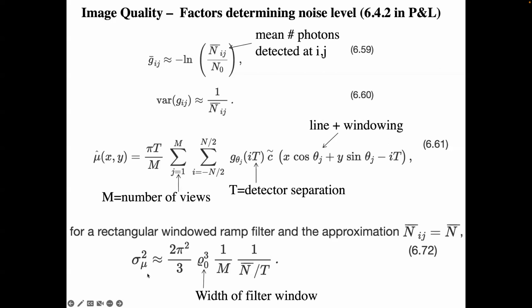for mu squared. So this is what basically kills you with the Ram-Lak filter, right? Is the fact that you give this remarkable weighting to high frequencies such that the noise gets amplified extraordinarily. And so even though your mu value may be more accurate and you may be better localized as you're going to higher and higher frequencies, the background noise is catching up to you, right? And so your signal to noise is going down because of this term, right?